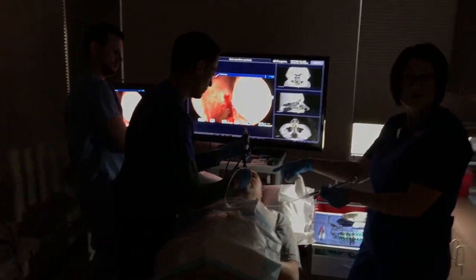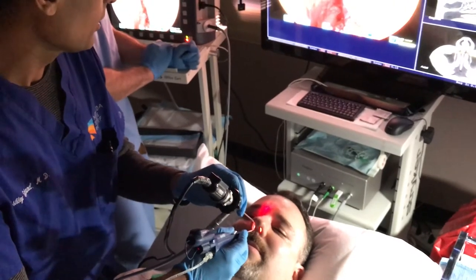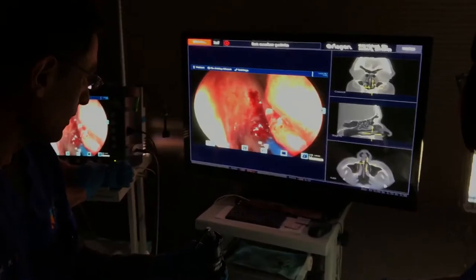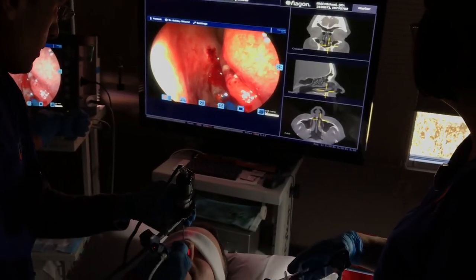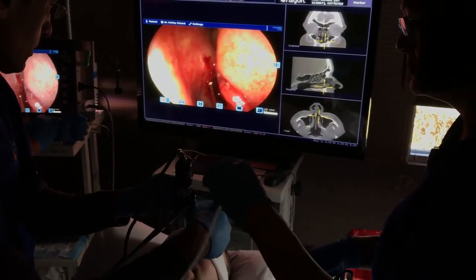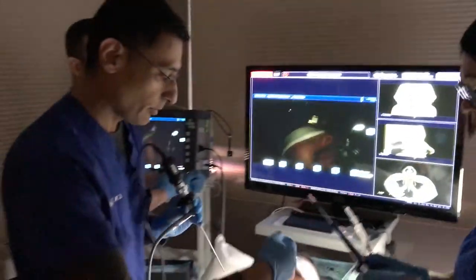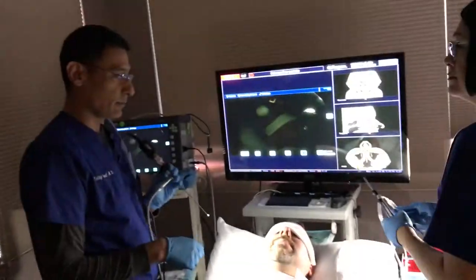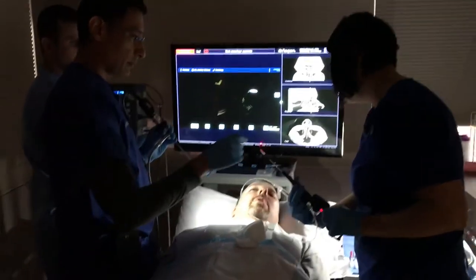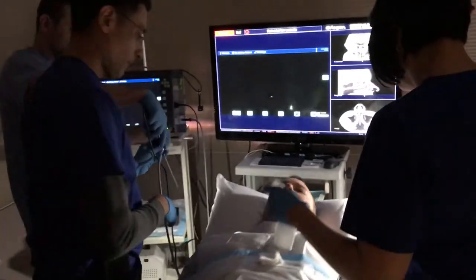I'm going to take the external picture there. See how it's lighting up? And I can even move it there. We'll pass the balloon — now take the internal picture. Go ahead and inflate that. And let's do it again. Now I'm going to withdraw the balloon and we can look way up in that sinus opening there. Can you show that to Michael so he sees what the balloon looks like and the fiber and the light fiber on it? Yeah, so that's where we're putting it up in there — there's the balloon. It's on a rail that goes back.